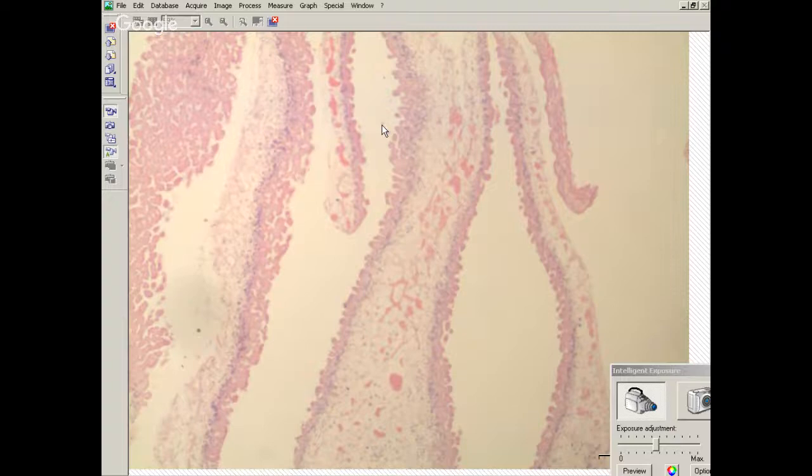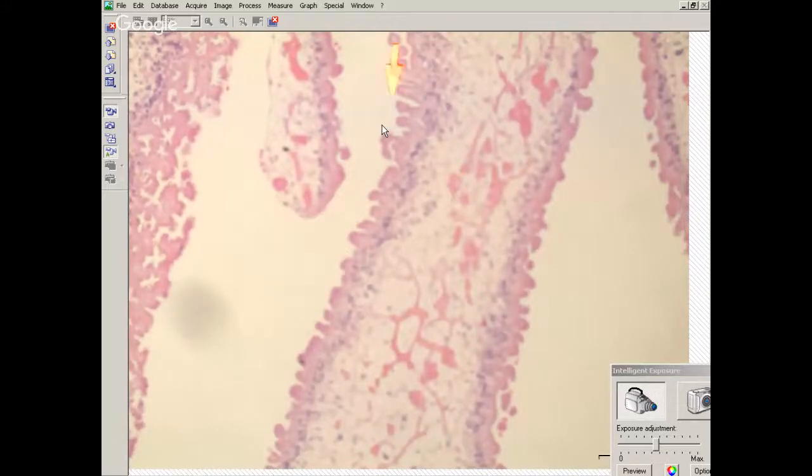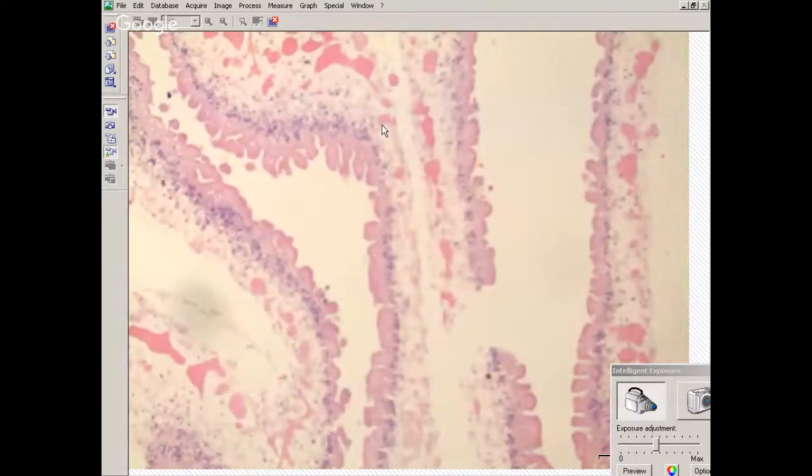This is the larva, and you have this very eosinophilic proteinaceous outer layer, and underneath that is a cellular zone, and then subjacent to that is a loose matrix. And I think this is the gut of the larva. So you see this, and it's pathognomonic. Cysticercosis is a dead-end organism in humans. A pig tapeworm. So if you ate the meat from a pig, do you get this? What do you get?